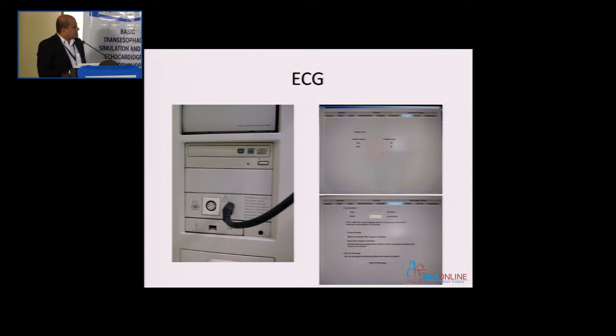The next thing is the number of loops you need to acquire. Most of the machines probably have one loop as the default. If you have one loop, it will just go click and then go back. Sometimes you may not get a good picture. So go to the acquisition and change to 4 loops. The disadvantage of storing 4 loops is your storage gets filled very fast.